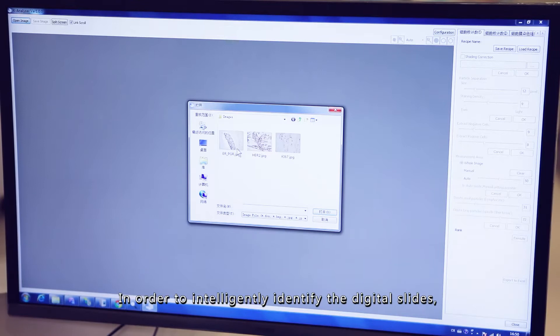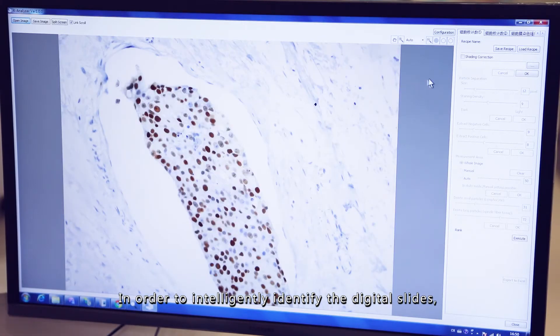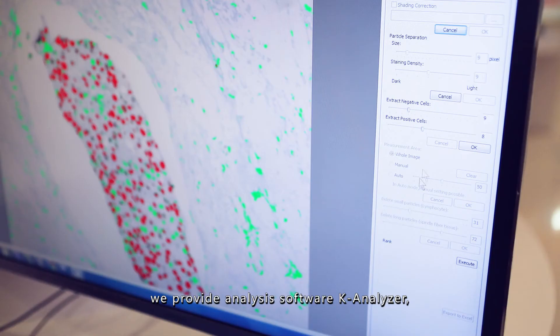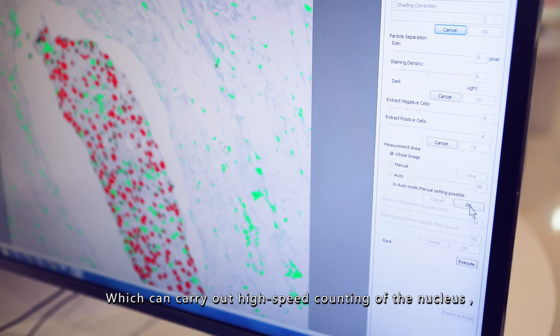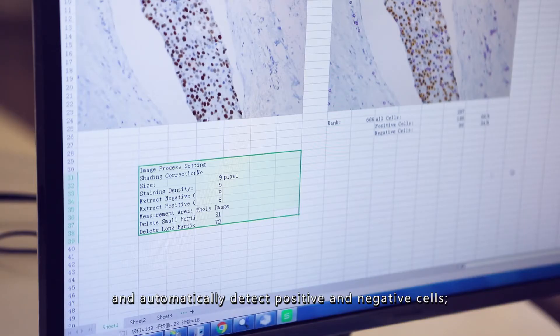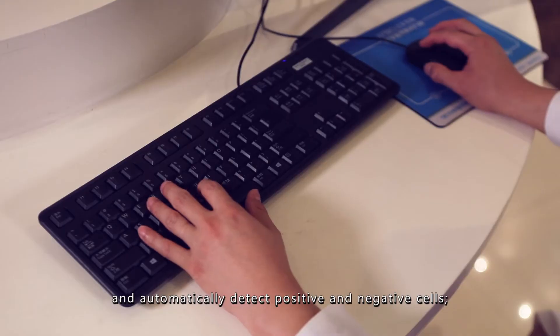In order to intelligently identify the digital slides, we provide analysis software K-Analyzer, which can carry out high-speed counting of the nucleus, and automatically detect positive and negative cells.